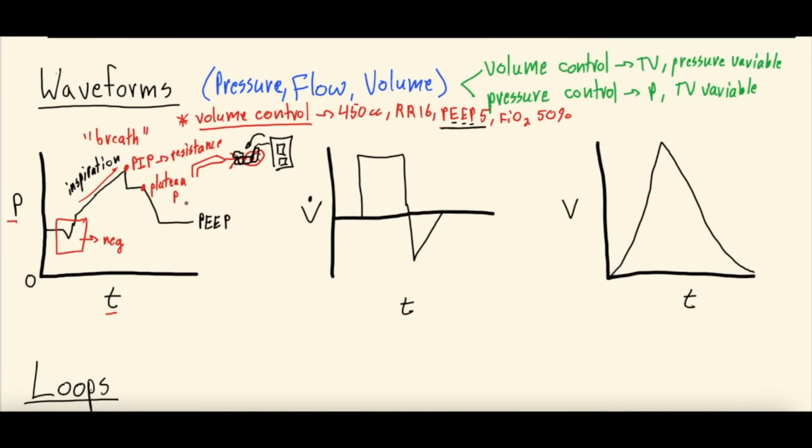And a plateau pressure is after the breath is pushed fully in. So picture the ventilator pushing that breath in. You then pause at that maximal amount of tidal volume. And the plateau pressure is this plateau that you'll see, which is representative primarily of the compliance of the lungs. Some other things contribute as well, such as how heavy the chest wall is and those types of things, which is out of the scope of this video discussion, but this would be the plateau pressure.